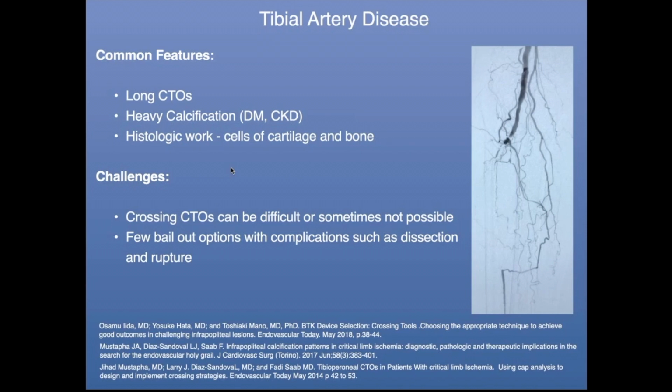Obviously, we've got a lot of these long drug-eluting stent trials that are taking place now. And what will happen is that adds something to the landscape.